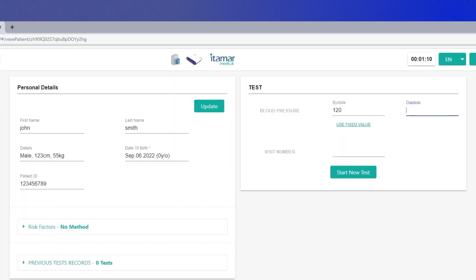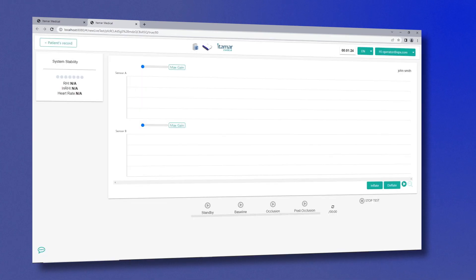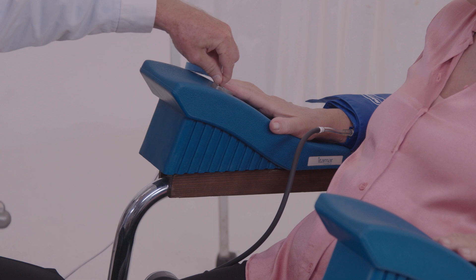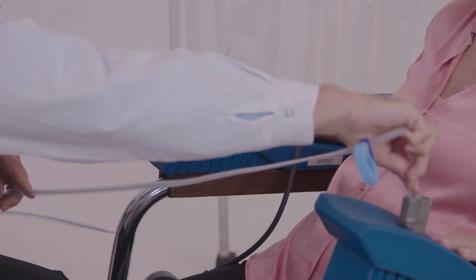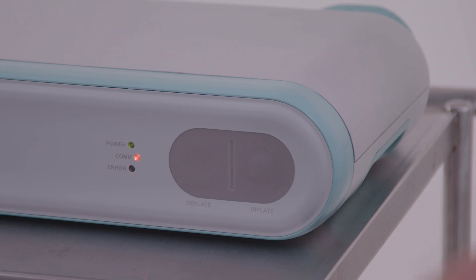Insert blood pressure results and visit number and click Start New Test. A new tab will open up. Select Open Probes and return to your patient. The pad probes should be placed inside the appropriate sockets of the arm supports. Fully deflate the probes by clicking the icon in the software or by pressing the deflate button on the device.